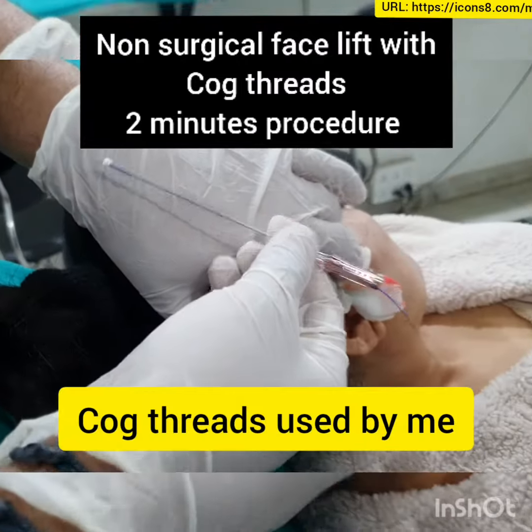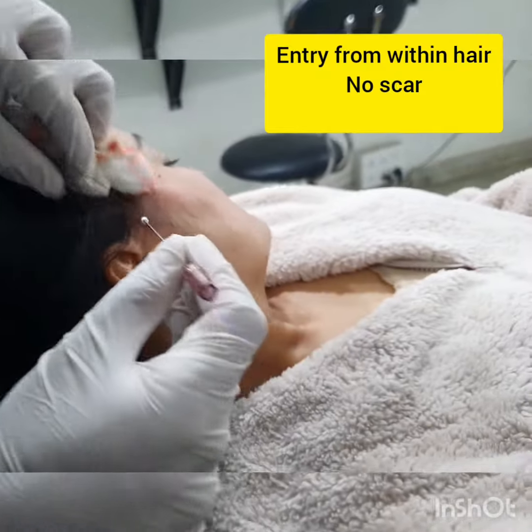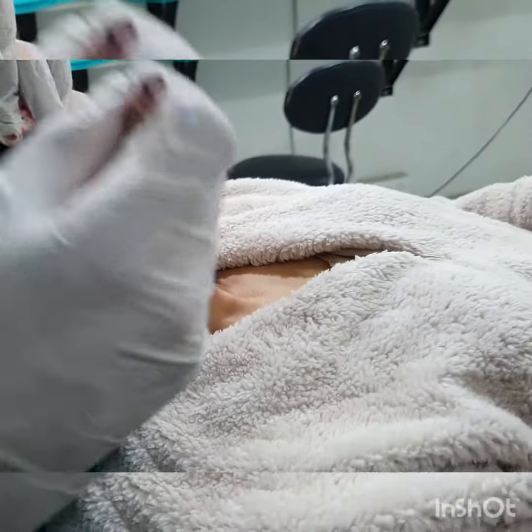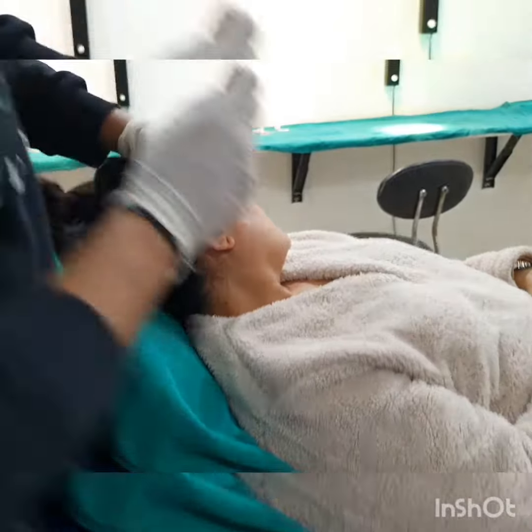Good morning. In this procedure I am going to talk to you about cog threads and how we do a non-surgical facelift. This is an amazing technique where within 2 minutes we can actually lift up the face, reduce the aging by 5 to 6 years, and convert a round face into a V face.